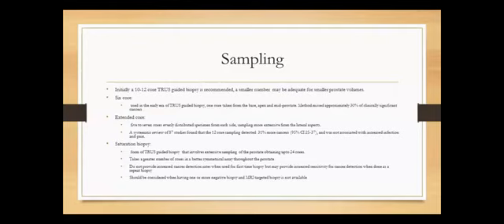There's another form of sampling called the saturation biopsy. Saturation biopsy is whereby we increase the number of cores per lobe, to a total of 24 cores. This number of cores is symmetrically distributed throughout the prostate. It is not advised as an initial biopsy in biopsy-naive patients, as it does not offer any superior benefit to the extended core sampling. But in cases of repeat biopsy, it does have some benefit in detecting cancer.